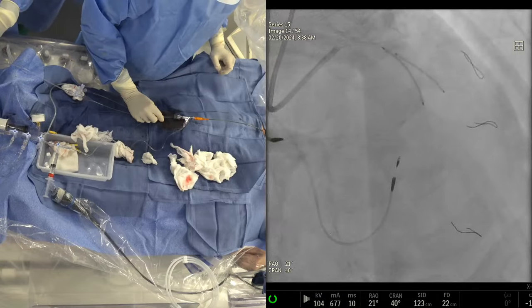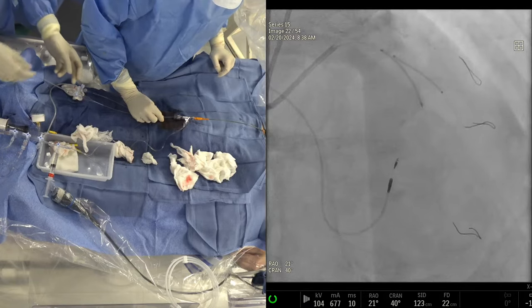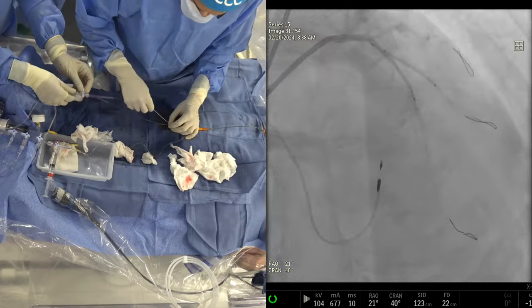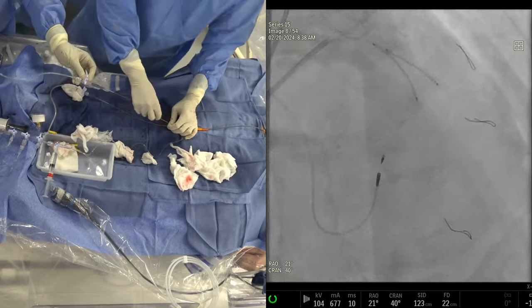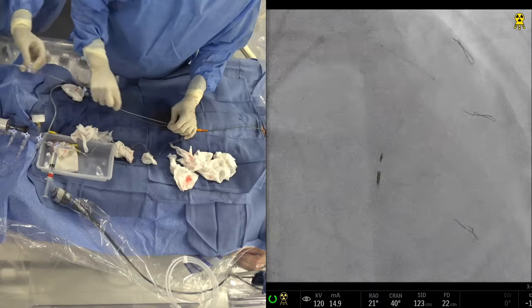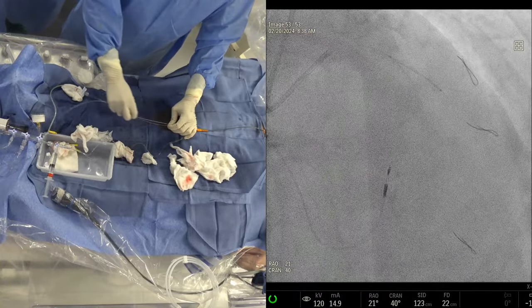So that's what I'm saying. We pull back, otherwise you go to 38. That's why I said, good, 38. Get a 3.0 by 38. Take this one out, LAD one. And this your one. Okay with the length for the diagonal? Yeah, the diagonal actually will push a little further in. We need to advance it further till we get the D1 stent. Then only get it.